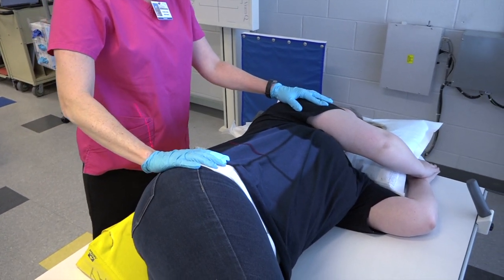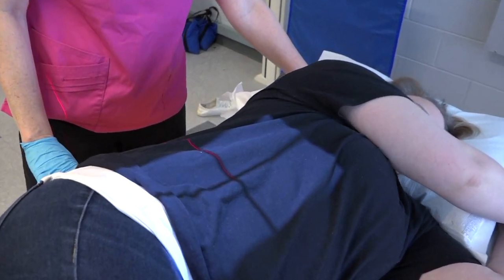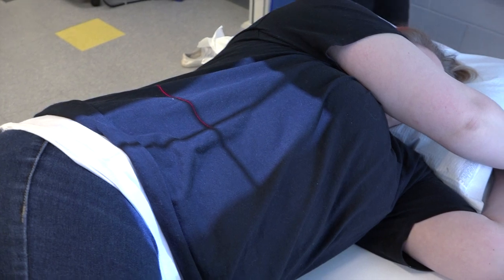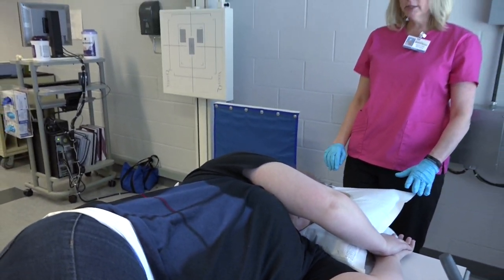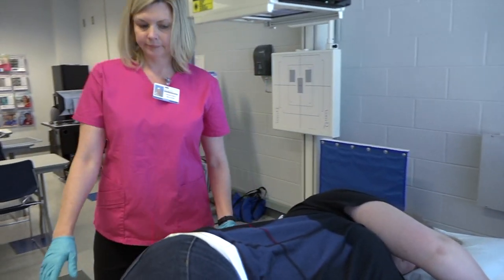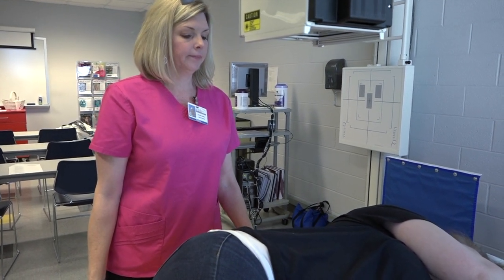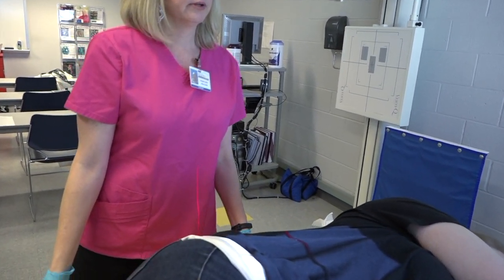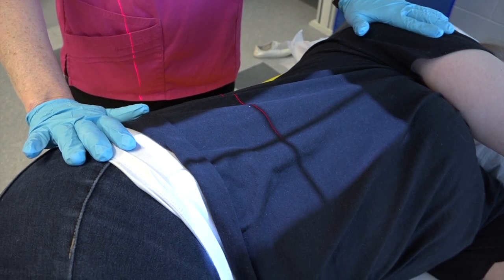There we go. Rotate just a little bit more. Okay. And roll your head all the way. There we go. Great. So if you'll go back and look at the head of the patient, they should be lined up with the ear. And we're looking for the zygapophyseal joints here. We should see the Scotty dogs in an oblique position.